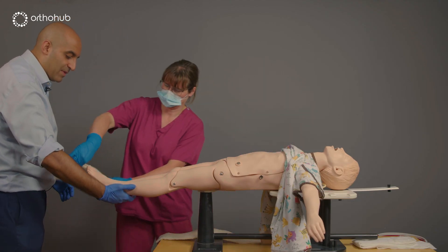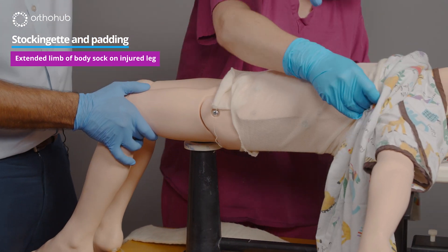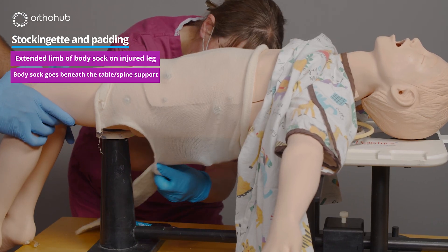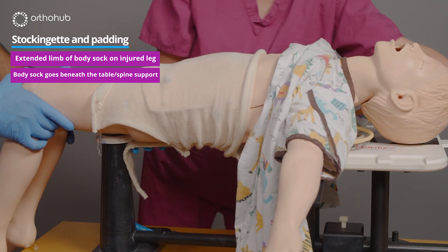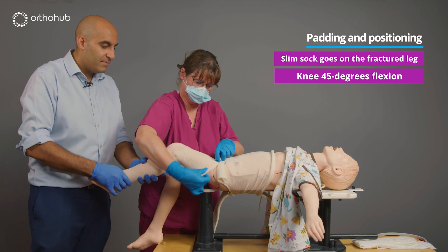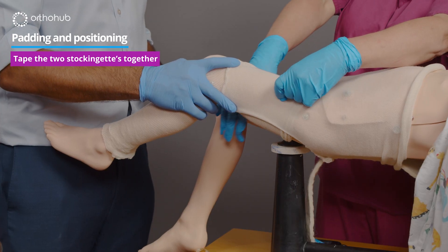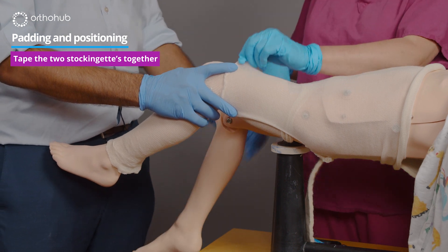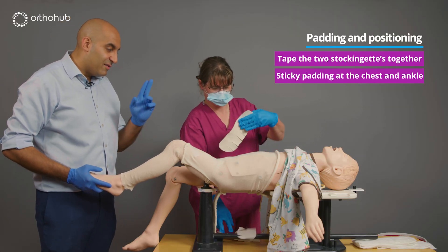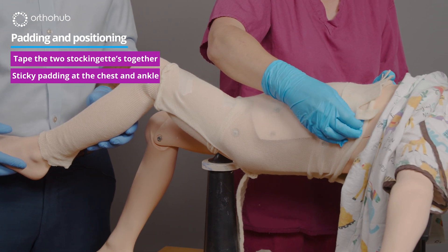This is the body stockingette with the long limb going down the fractured leg. You lift the child slightly, bring the proximal part up to the level of the nipples and stretch it down. We place some extra felt at the back since the child will be spending significant time on their back. We also use sticky felt cut into long strips, placed at the top and at the level of the ankle.